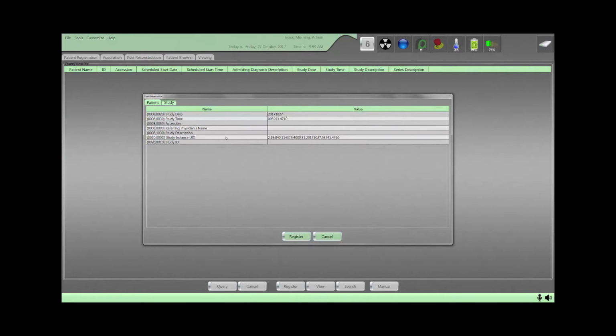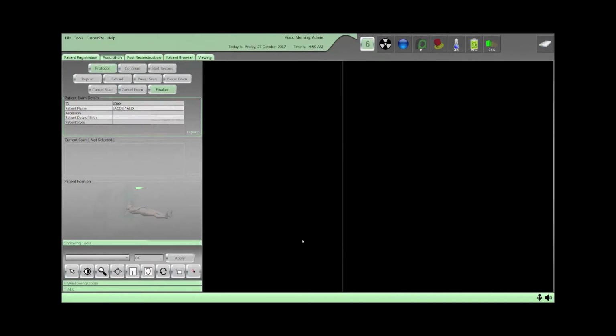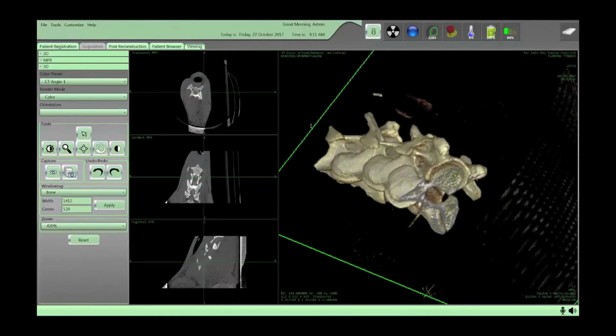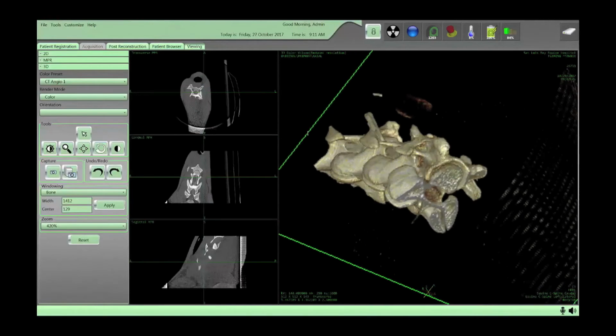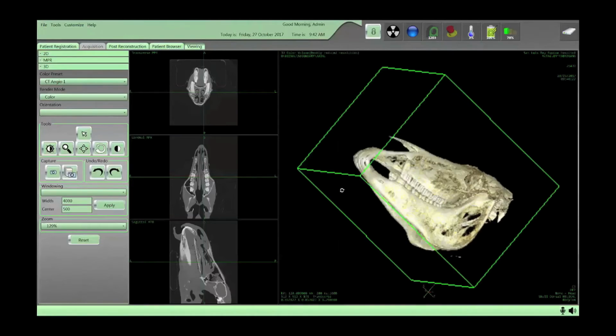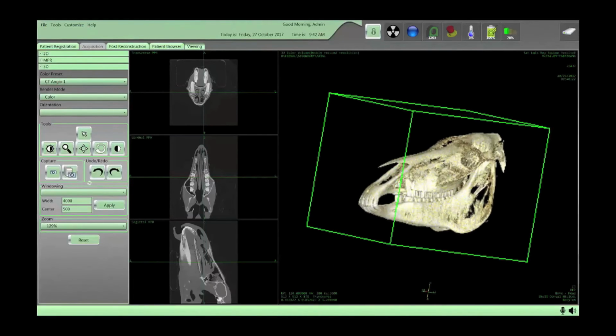We have the ability to view the images as they're acquired, and then we can do any degree of post-acquisition reconstruction on the images. So the BodyTom software has very good 2D, 3D, and multiplanar reconstruct imaging. So we're able to do that at the time or immediately after acquisition. And then we're able to post-process the images as well if there's a preference prior to sending those to a radiologist or to another PACS viewing software.